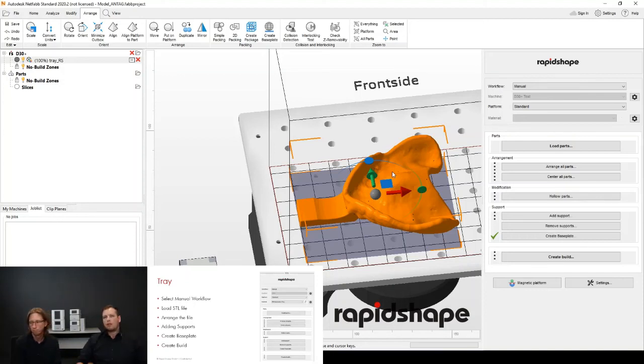Yes, so it's not so much vertical or horizontal as it is what your workflow is designed for. You could even have these at a slant, similar to a splint, so to speak. Depending on the design itself, though, because if you have overhanging areas, this will probably cause problems in your final product.